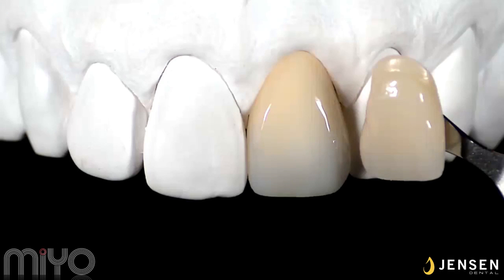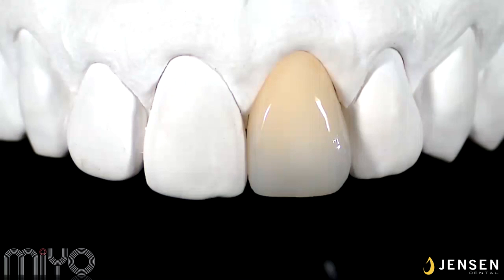Now slightly intensify the mesial and the distal corners to mimic that transparent effect on natural teeth. Don't worry about puddling and spotting from all the color applications. This conventional issue we see today in monolithic restorations will be corrected with structure material and will add a blending effect of all colors, plus the scattering effect of a layered ceramic.